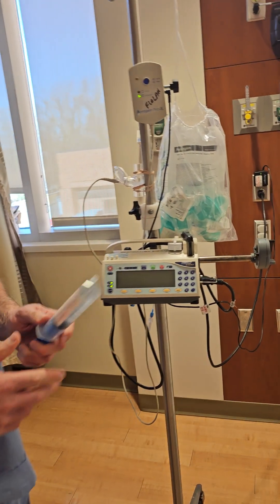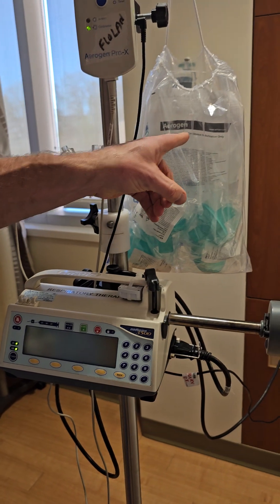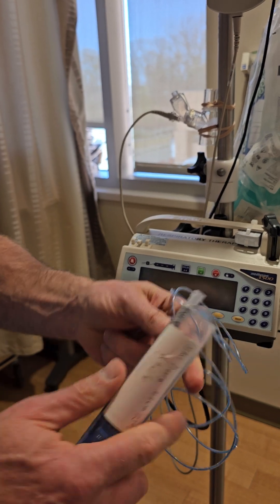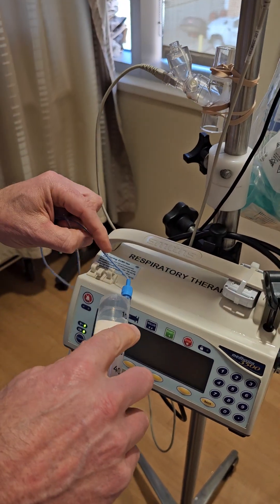Starting out, we have our Flolan syringe. We need to connect the tubing to it — I have some here in this white package hanging from the pole. Start by putting the tubing onto the syringe, screwing it on, and then we want to put it into the pump.